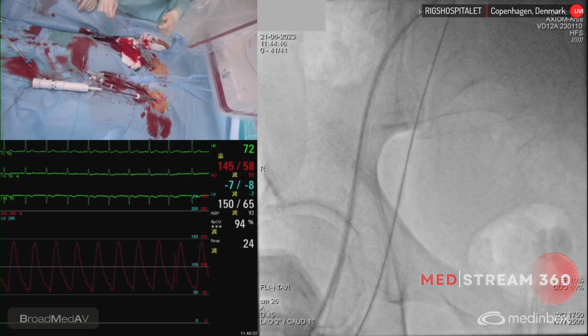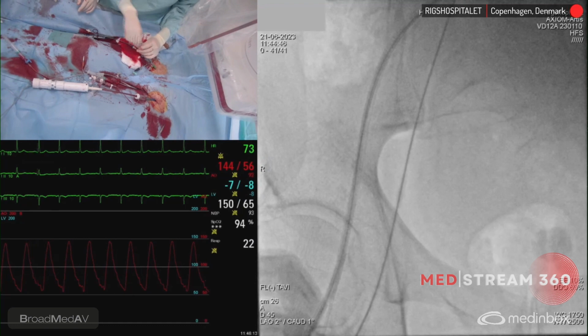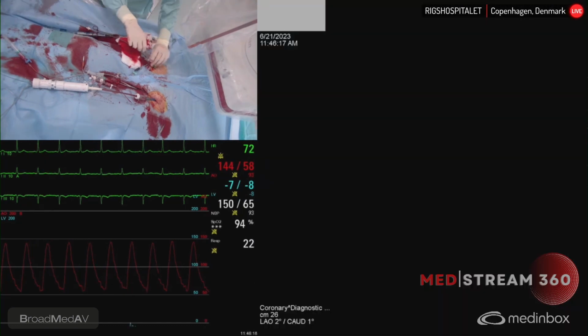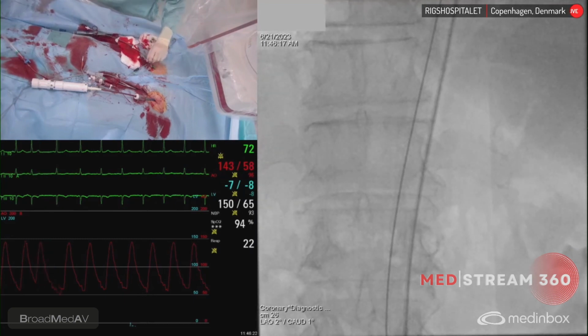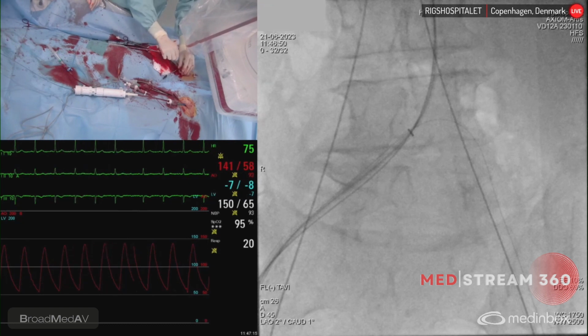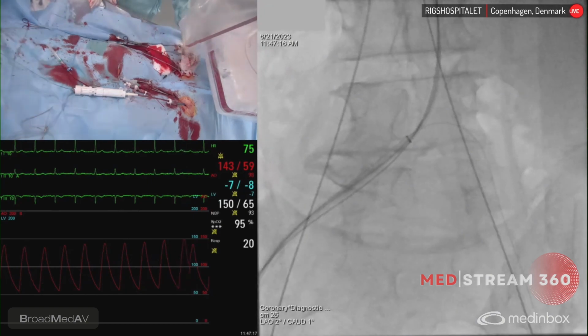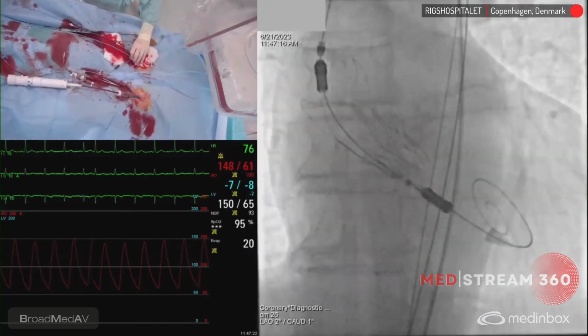Yeah. All right, good. So what we're going to do is, while the valve has come off from the catheter, but the catheter is still in the LV, we're just going to cross the valve again and then dilate it up with a balloon so that we get the valve more expanded. Yeah, that's the whole idea. And then, of course, crossing the Acurate, we have to follow some specific rules there. It's not the easiest, but let's manage to do it.